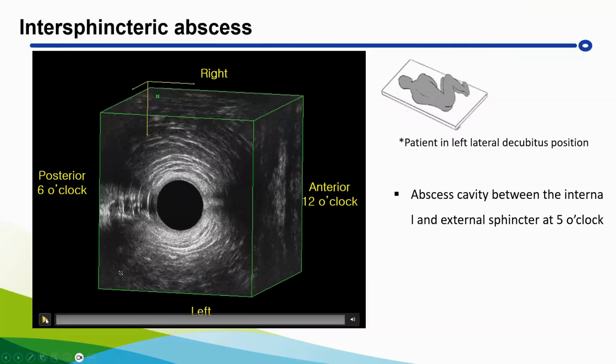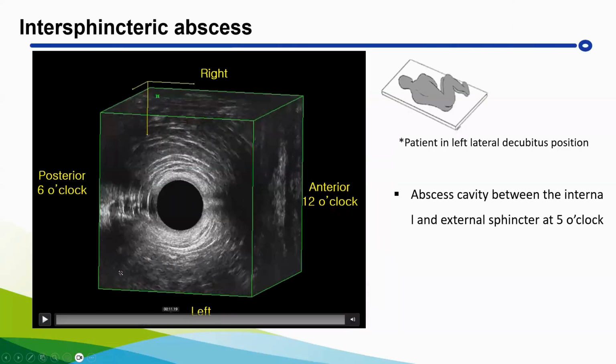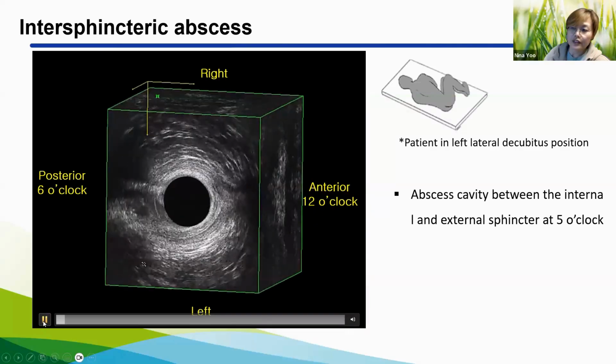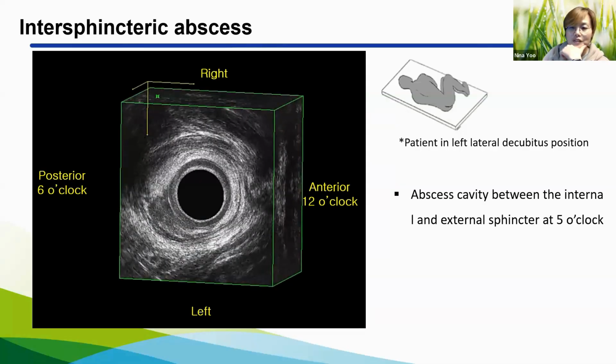Do you have the video up? The video will play now. All right, good. Okay, here. Now you see here there's the abscess.